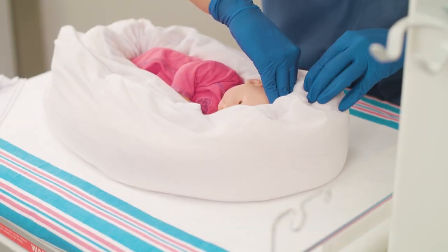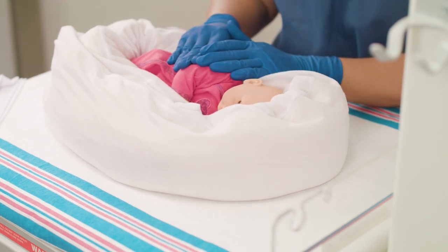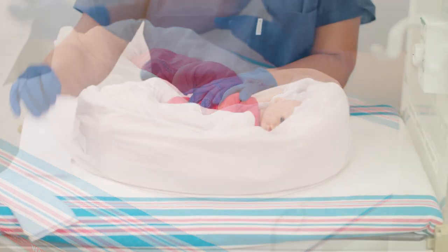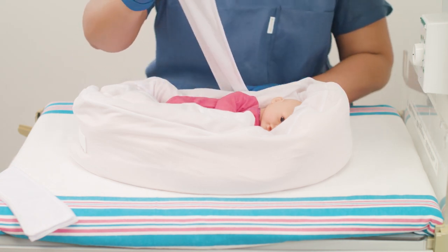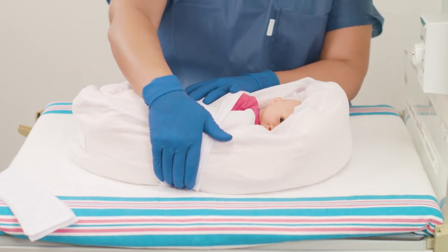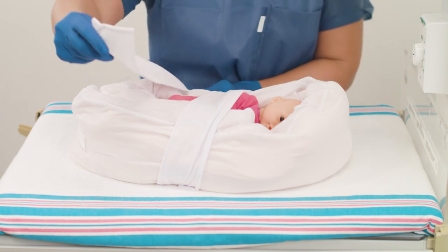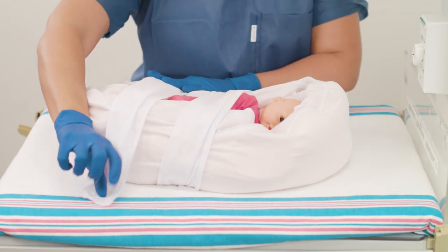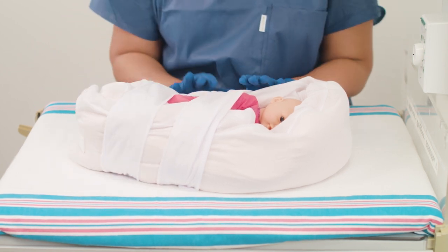Support the head and mold the sides of the positioner around the head. Use the separate straps to maintain the positioner's shape and achieve a contained position. Straps can be used full width or folded in half. Finish by ensuring that the head is well supported and breathing is not obstructed.